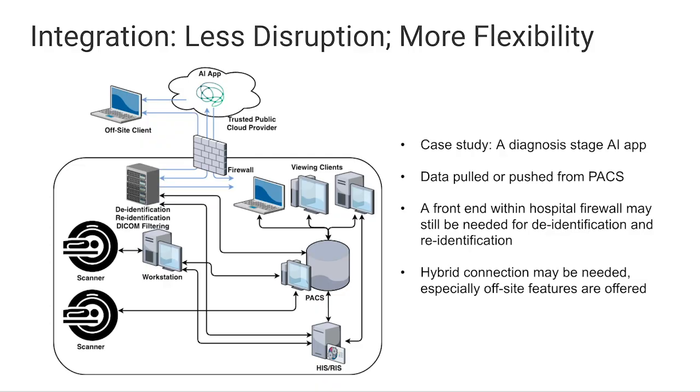Also, sometimes the users might want to use the app from an off-site location. Some radiologists might want to view their images from a home office, or some imaging centers might commission some of the viewing tasks to a contractor, a radiologist contractor. So it's very common for these apps to provide off-site connection.